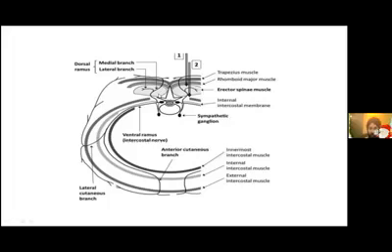So if we see this slide, this is the target, number 2. Number 1 was the target first defined by Dr. Agarwal when he described this block initially, but then gradually what was found was that a suitable target is deep to the erector spinae itself, in relation to the transverse process.